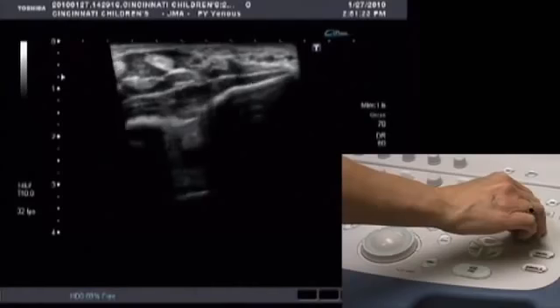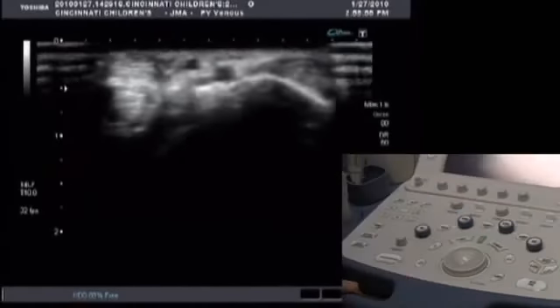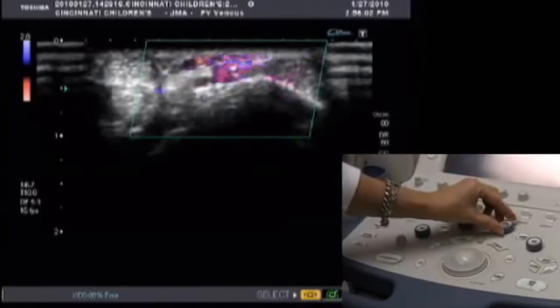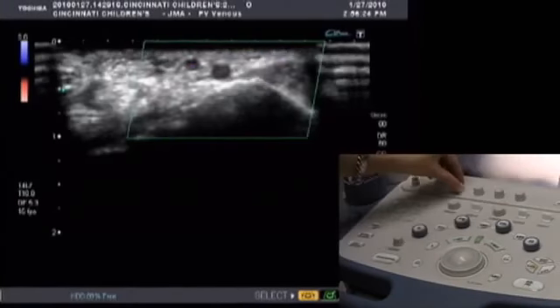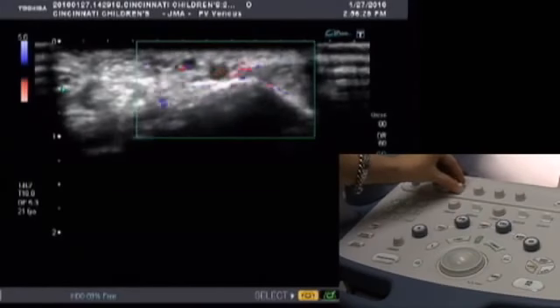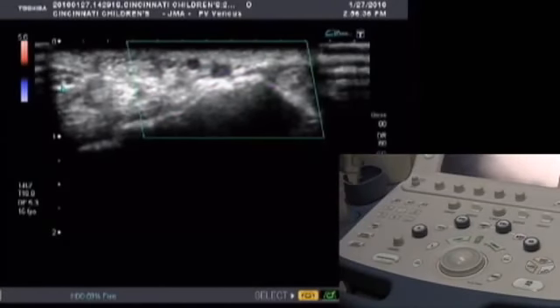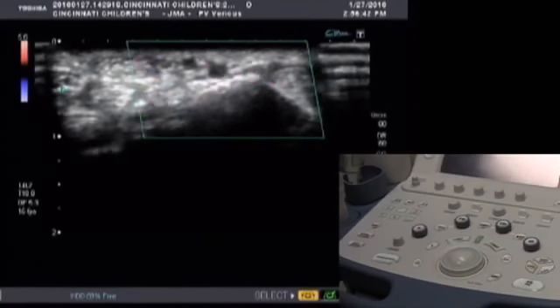Adjust the depth of your picture by turning the depth zoom knob. Activate your Doppler by pressing Advanced Dynamic Flow or ADF. Then adjust the Doppler by turning the CDI knob and the scale knob. Adjust the color Doppler box — the green box on screen — by turning the CDI steer button. Advanced Dynamic Flow works best when not at 90 degrees, so the box should be at about 60 degrees.